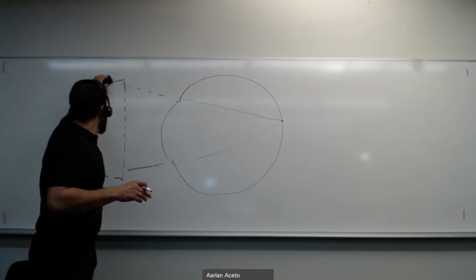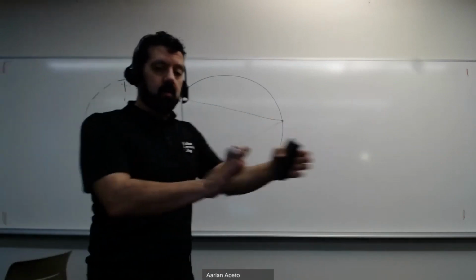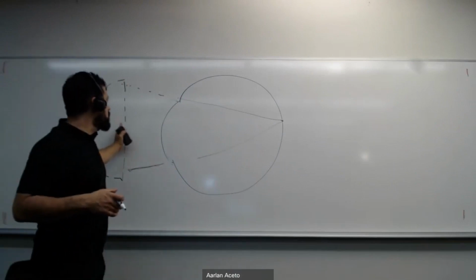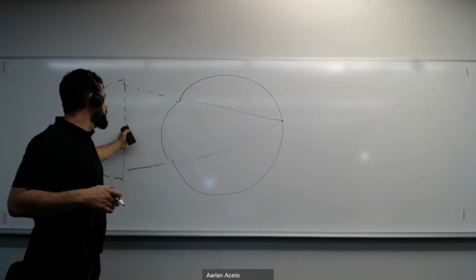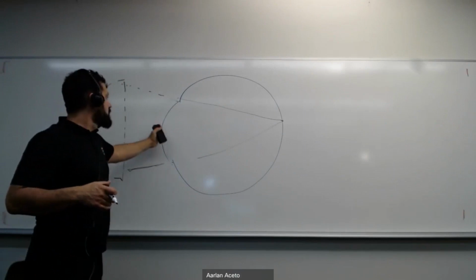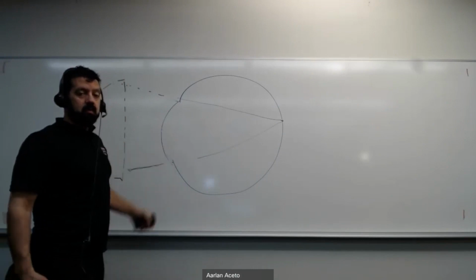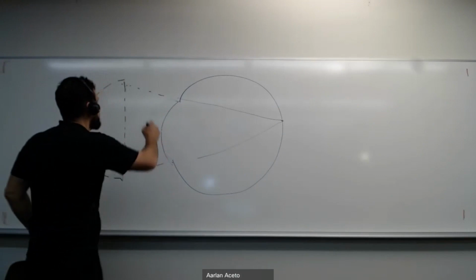And in this case, contacts are easy. Unlike glasses where we have to move it farther or closer away, contact lenses by definition always go closer, and they always go closer by the entire vertex. If this was 14, the vertex distance for a contact lens is by definition 0 millimeters. So we will have moved it by 14 millimeters.